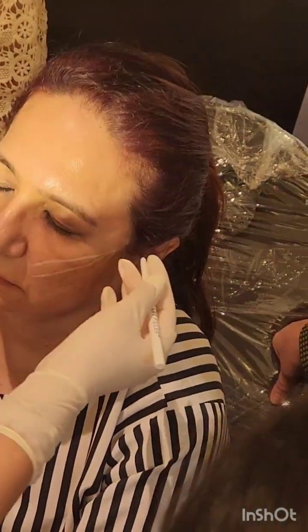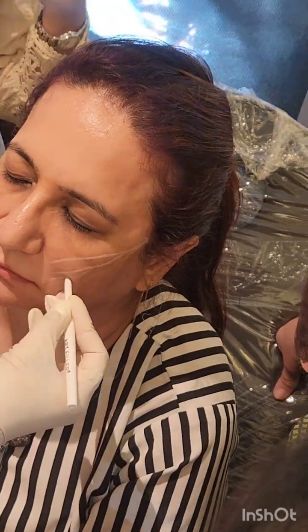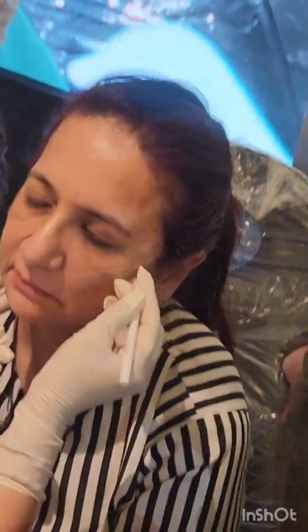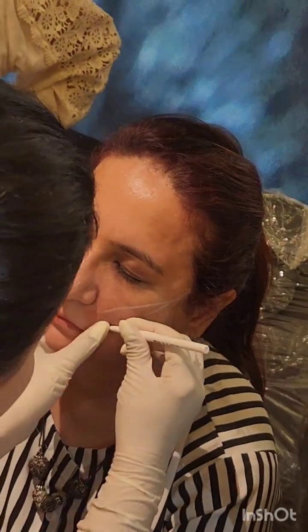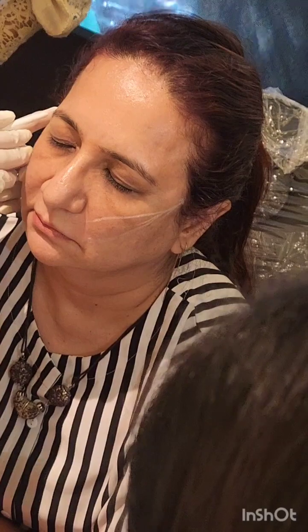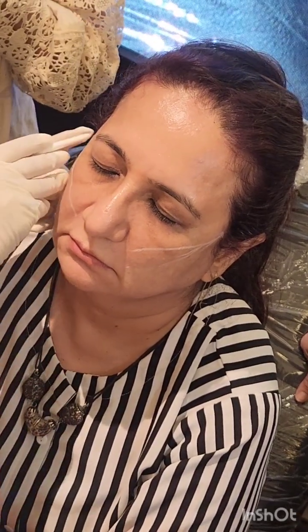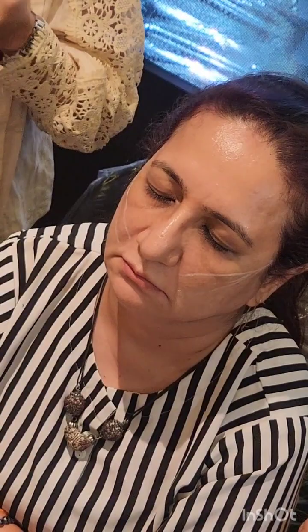Okay, so this is our vector. She has a younger face. The idea is, I'll tell you about the reverse thread also. There are screw threads and cog threads, and the cost of the thread differs. We have to lift the marionette line. One more thread. This is the safe one. All threads are safe actually.